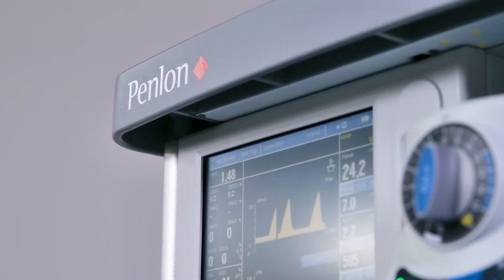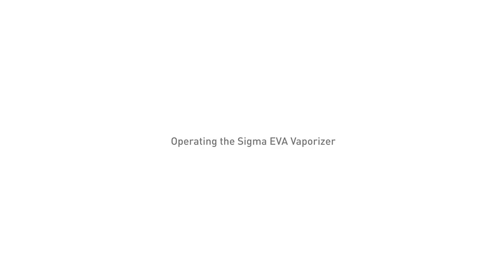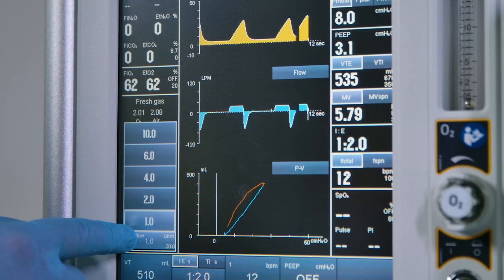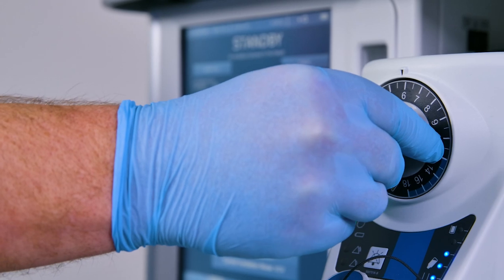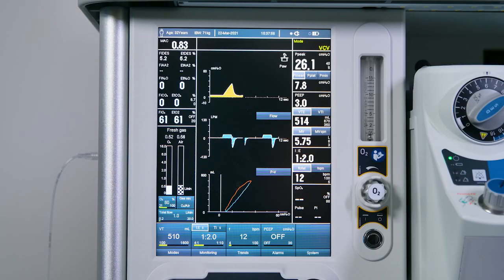Daily pre-use checklist: complete the pre-use checklist as detailed in the Sigma EVA user manual. To deliver anesthetic agent, check that the power supply indicator is continuously illuminated. Set the required fresh gas flow on the anesthetic machine within the range of 0.2 to 15 litres per minute. Push in the control dial and rotate anti-clockwise to set the required agent concentration — this must be greater than 1%. The vaporizer will commence delivery of agent into the fresh gas flow.